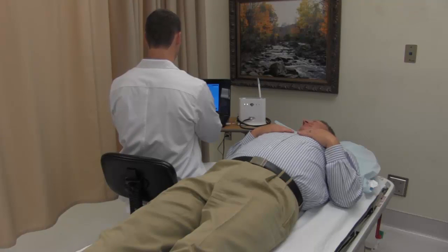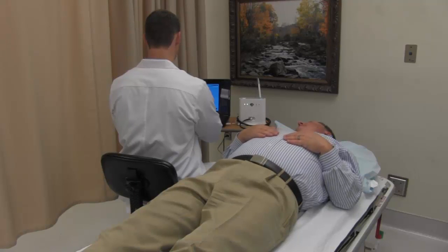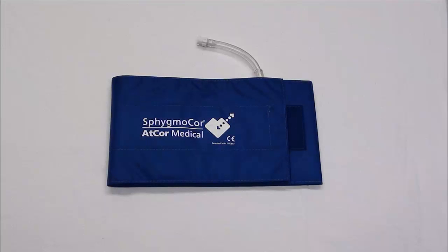If the screen is in a position that is difficult for the operator to view, it could make data capture challenging. To prepare for pulse wave velocity, the patient should be in the supine position and have rested for at least 5 minutes before beginning the assessment.